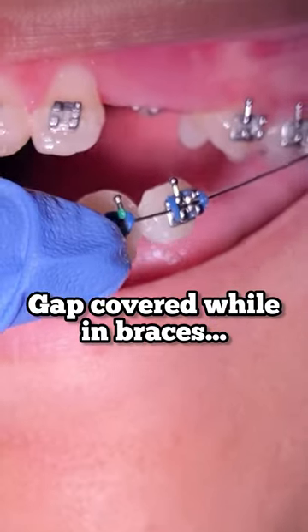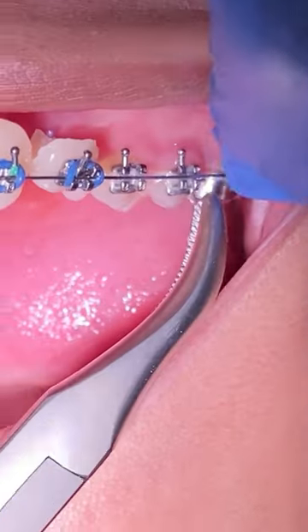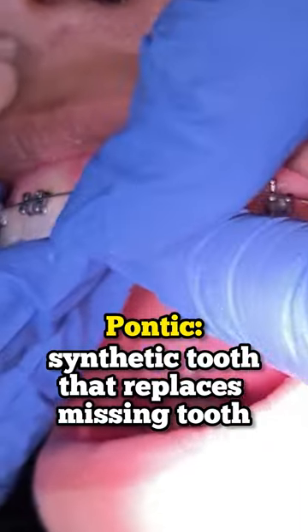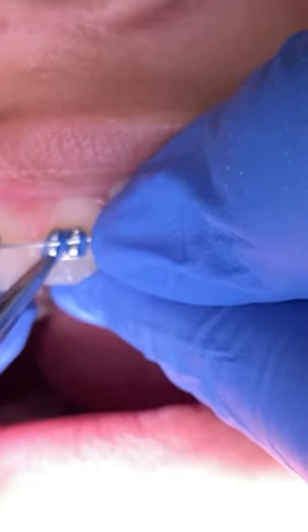Hey everyone, this is Abby your hygienist here at Toots and Family Dentistry. Today's video is pretty cool. We're going to go ahead and show you how we placed a pontic tooth — actually, we placed two to cover the space of the impacted upper left three canine.